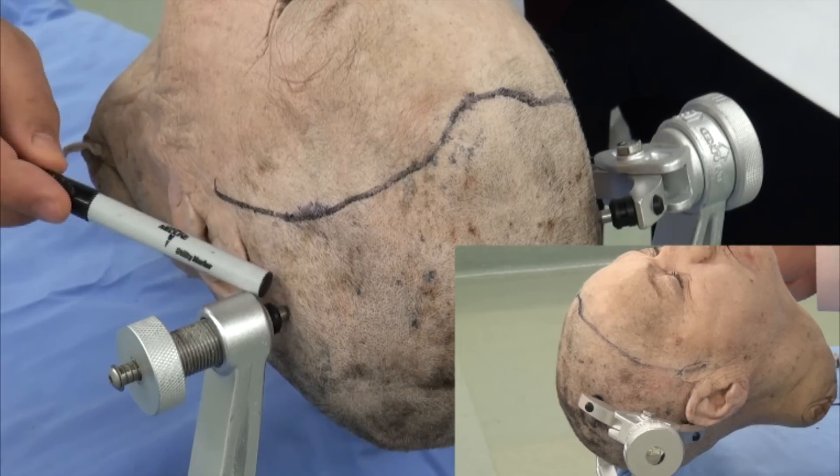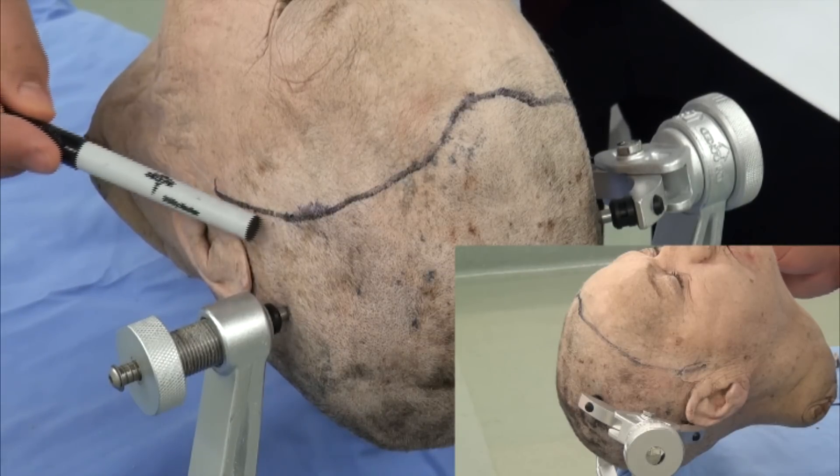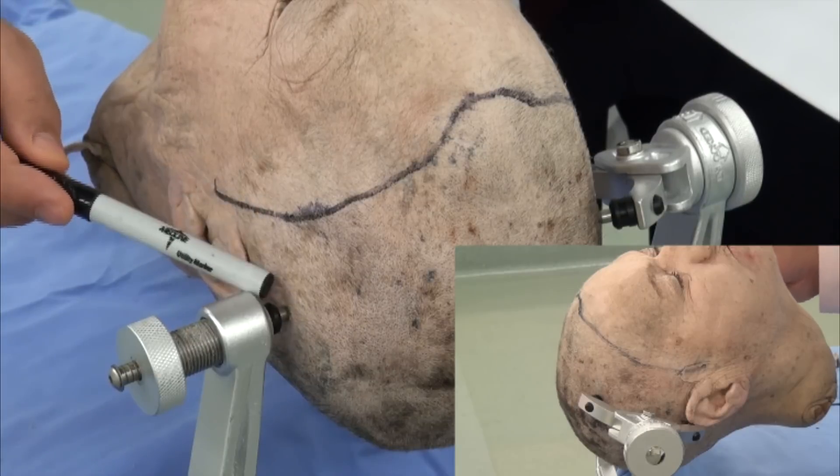Ample space is kept posterior to the incision to prevent any tension.